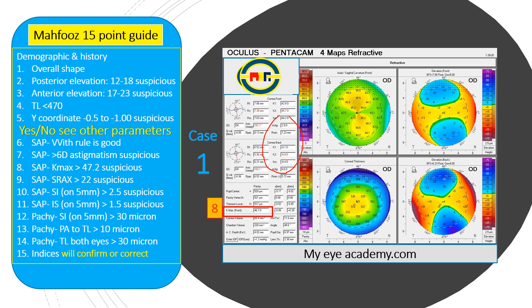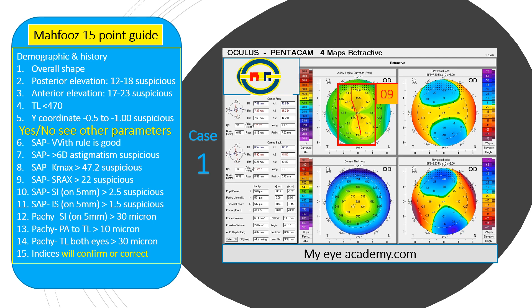Number seven: astigmatism is less than six diopters on both the anterior and posterior surface, so that's again normal. Number eight: K max is less than 47.2, so again normal. Number nine: there is no srax — the two prongs of the bow tie are right opposite to each other. Number ten: the superior-inferior difference at the five millimeter map is less than 2.5, which is again normal.